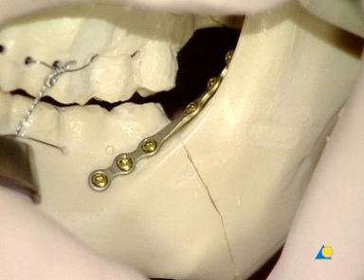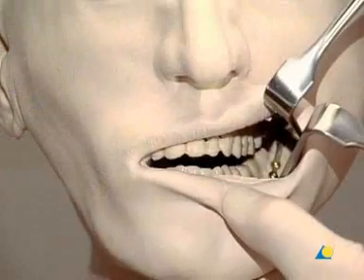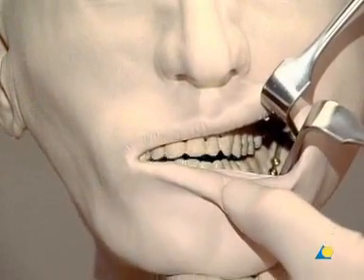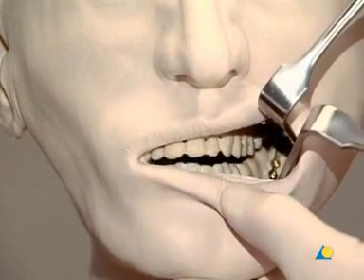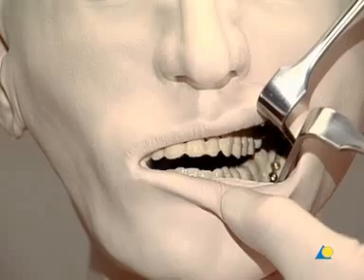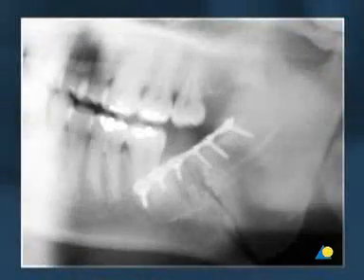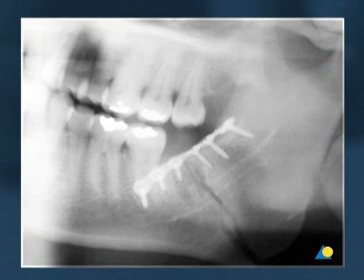The Ernst ligatures can now be removed. The mandibular angle fracture is satisfactorily fixed, and the mandible is functionally stable. The clinical result is shown in the post-operative radiograph.